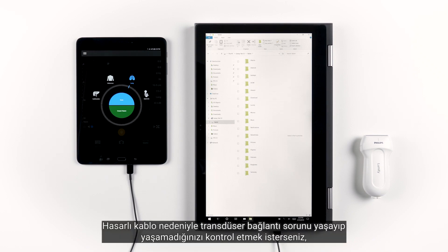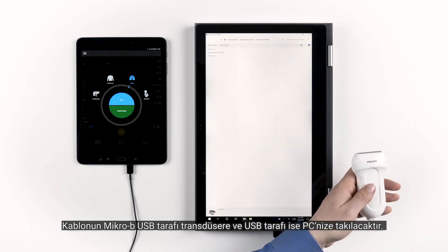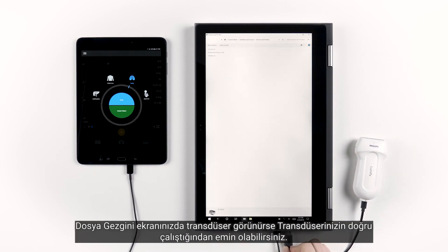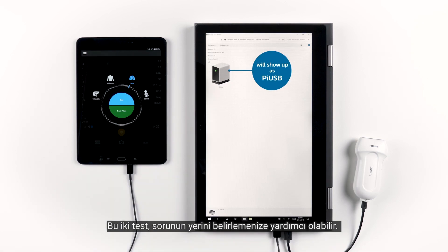If you want to check whether or not you might be encountering a transducer connection problem because of a damaged cable, you can detach the cable from your transducer and then plug in a Micro-B USB to USB-A cable. The Micro-B USB will go into the transducer and the USB-A side will plug into your PC. If the transducer shows up in your Document Explorer, then you know that your transducer is running properly.